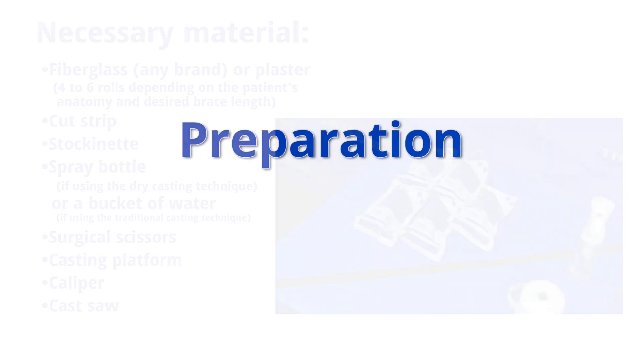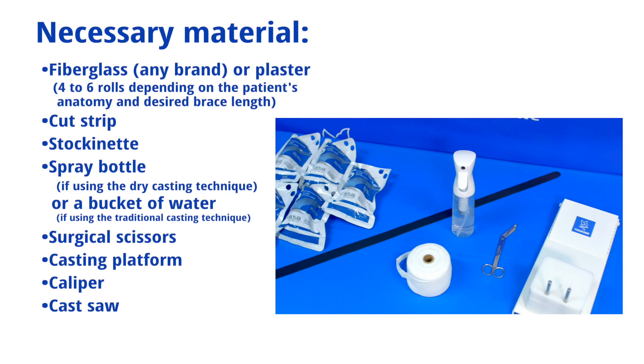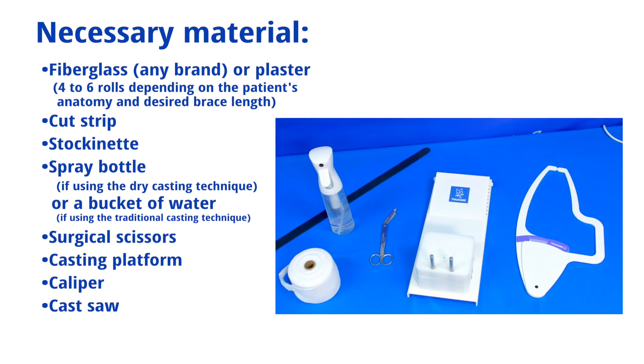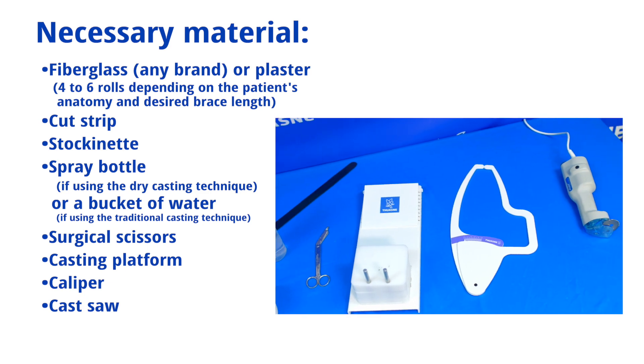Before you begin, make sure you have the necessary materials: fiberglass or plaster, cut strip, stockinette, spray bottle or bucket of water, surgical scissors, casting platform, caliper, and cast saw.